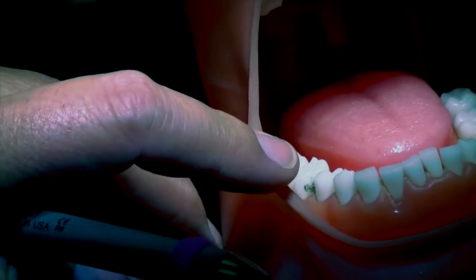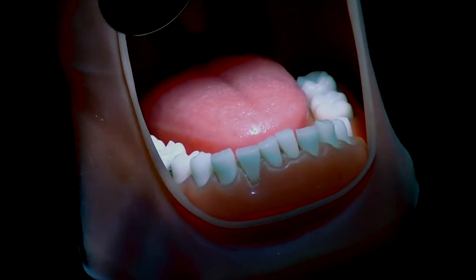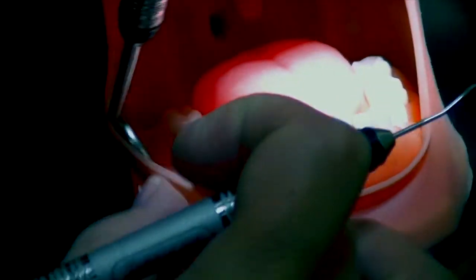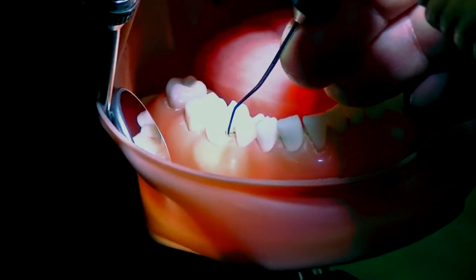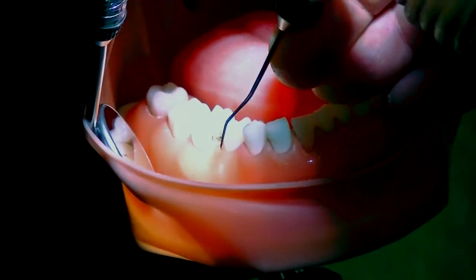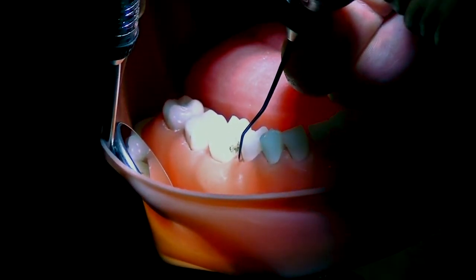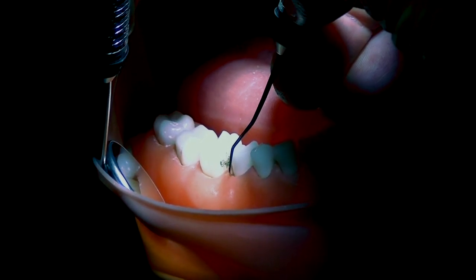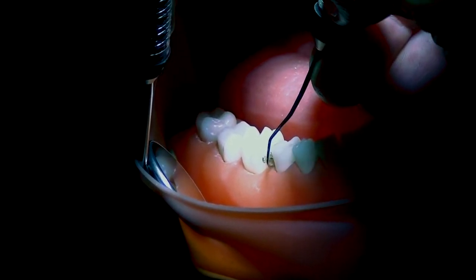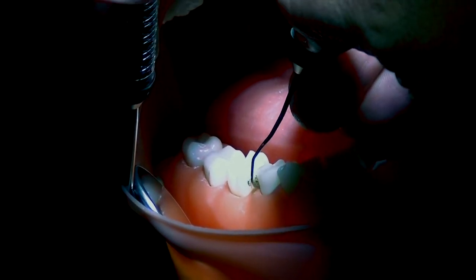Okay. So when we're using this instrument in the posteriors, we'll start with the posterior tooth. You're going to insert the tip at the distal line angle. You want to go to the bottom of the pocket, assuming this is a 2-3 millimeter pocket. And then you're going to want to make wrist motion activation, vertical strokes interproximally.